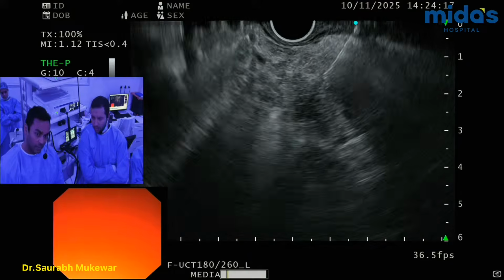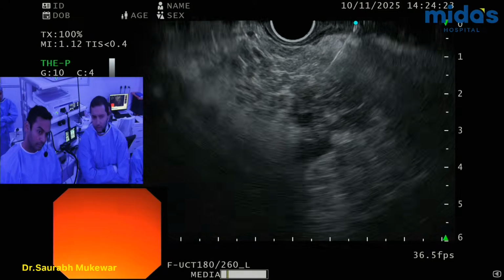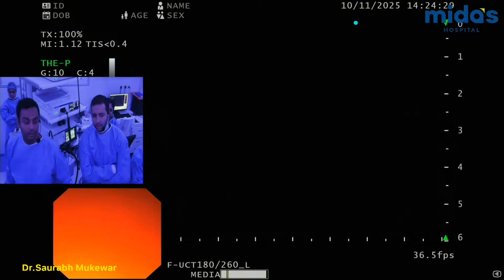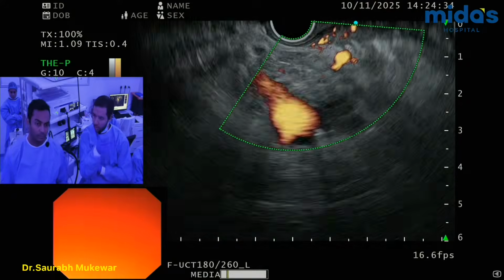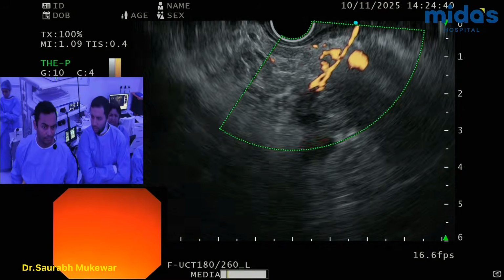The slow pull is a good one, less bloody sample, but then that can be a real problem, like those cases where you have a semi-cyst and semi-solid mass. The question I was about to ask: when you use the syringe to have a negative pressure, do you also have some sample to send to the cytologist?